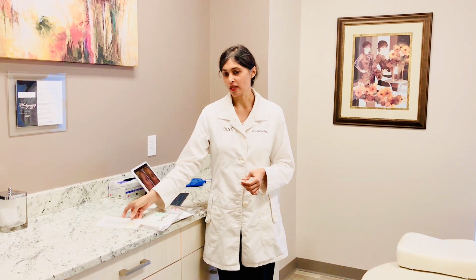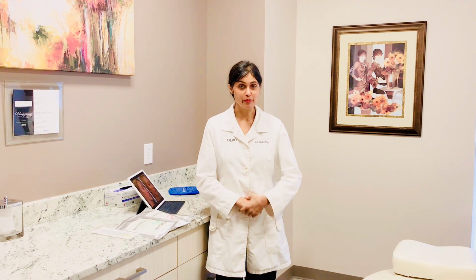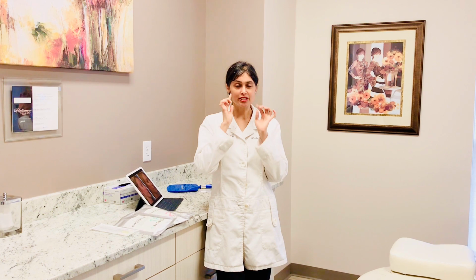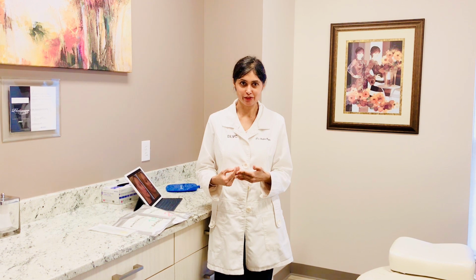So the threads, once they're placed, they cause a bit of an inflammatory reaction. There can be a little bit of discomfort with the threads. You might feel a little bit of a burning sensation. You might sometimes feel the little barbs just kind of poking through your skin. These symptoms can last in some patients just for 24 hours, and in some patients they can last for 2 or 3 weeks. But of course, all of those symptoms gradually subside. You can see an immediate lifting and tightening effect from the thread, so it's really nice that way.